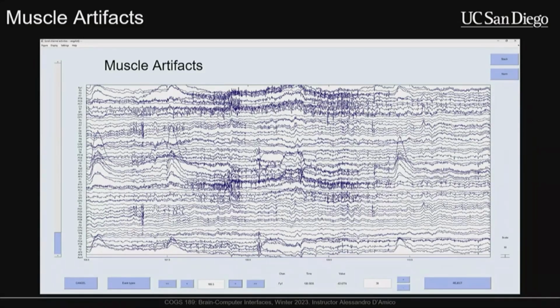We don't want to see these high frequency bursts of high amplitude noise in our data. And we can also see that the participant does a bunch of blinks as well. So they're blinking a bunch, scrunching their face. They're getting comfy because they're going to have to sit through, in total, 30 minutes of this horrible task that I'm making them do. And they're probably getting to the point now where it's like, okay, this is actually really terrible, I need to take these breaks seriously. Sometimes you'll have subjects that are like, nah, I don't need the breaks, let's go. But it's like, nope, you have to take the breaks. I'm sorry. Sometimes you know better than your participant about what they need.